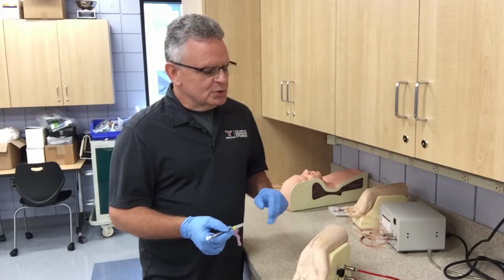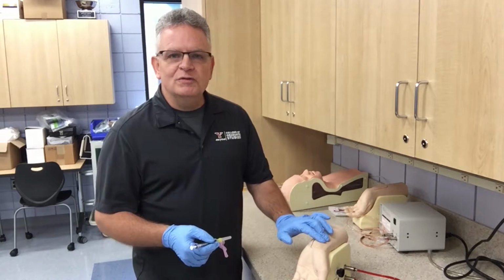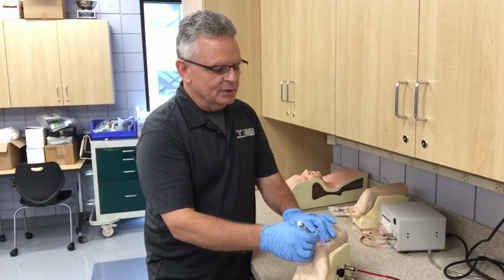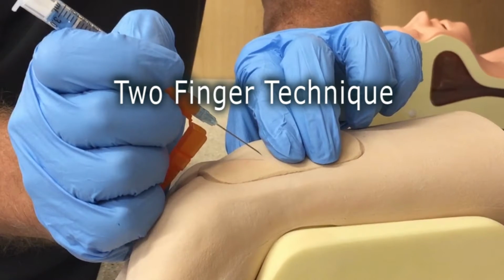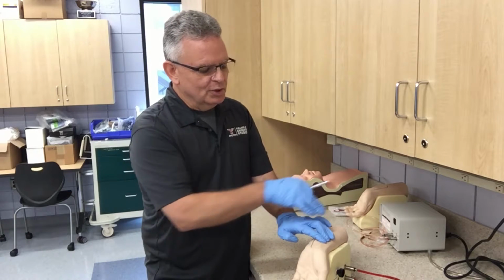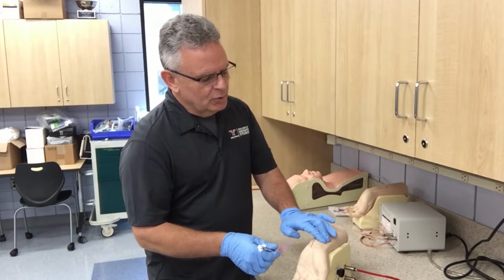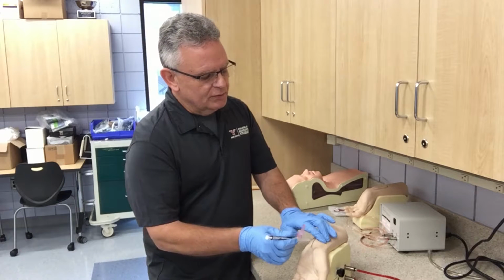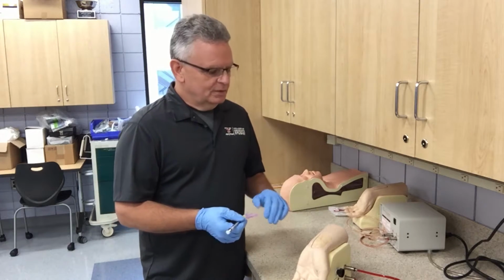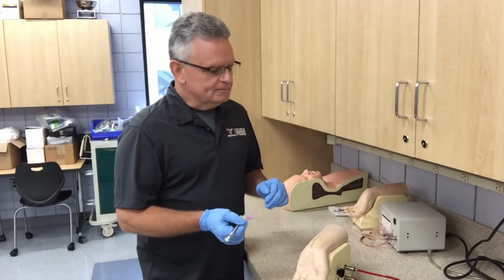Most of the procedures for arterial blood gas punctures will show the palpation being done with 2 fingers and the puncture being done just prior to the finger here. Some will have 2 fingers to start with, and again the finger is perpendicular to the artery, which is running this way down the arm. Some will have demonstrated with lifting 1 finger just prior to the puncture. The technique that I'm going to demonstrate is a slightly different technique that I call the Sal technique.